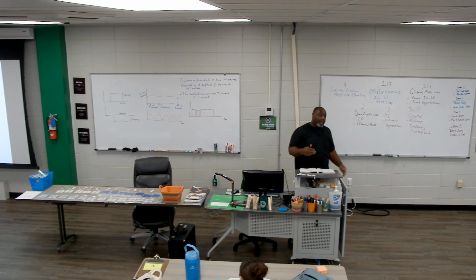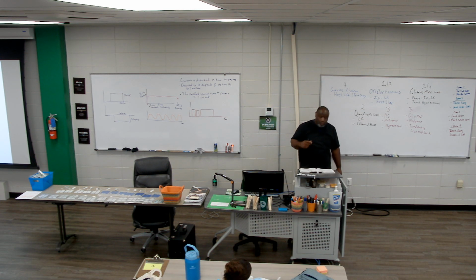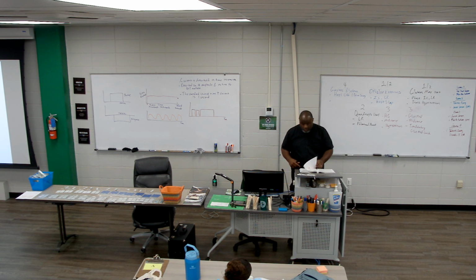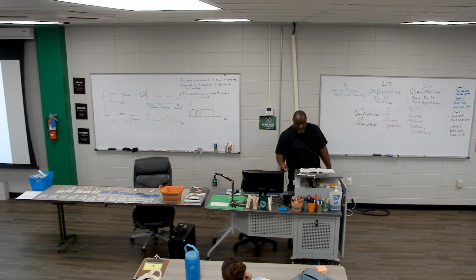So I'm going to keep saying that. I choose waveforms based on what my goals are. Currents and waveforms are things I choose based on what my goals are and patient comfort. You will select those based on what your goals are and trying to accomplish patient comfort. So those are the things we can have relating to pulse current. It can be monophasic, it can be polyphasic, it can be biphasic symmetrical, biphasic asymmetrical balanced, biphasic asymmetrical unbalanced.